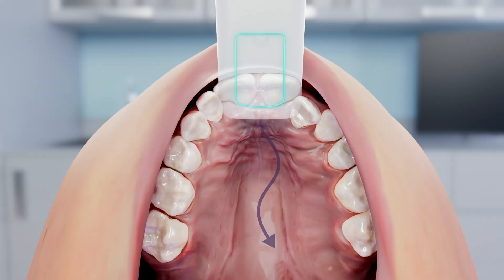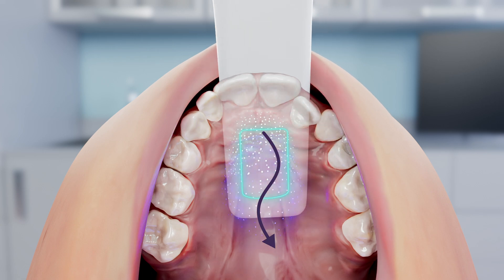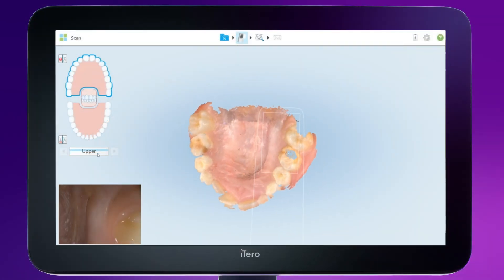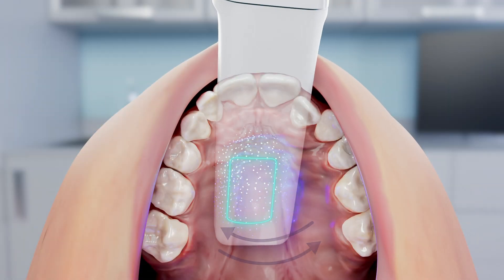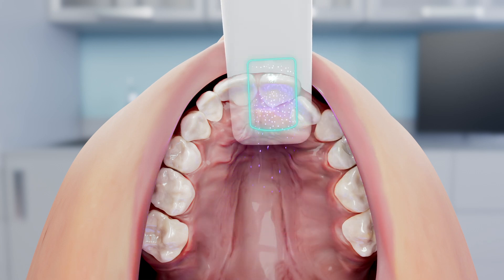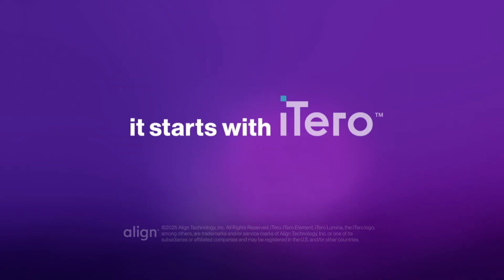To perform a scan for a deep palate, after making a quick occlusal sweep, place the wand parallel to the occlusal plane close to the palate without touching the tissue, so the base of the wand faces toward the front teeth. Tilt the wand using a rocking motion from side to side to capture the palatal anatomy. It starts with iTero.